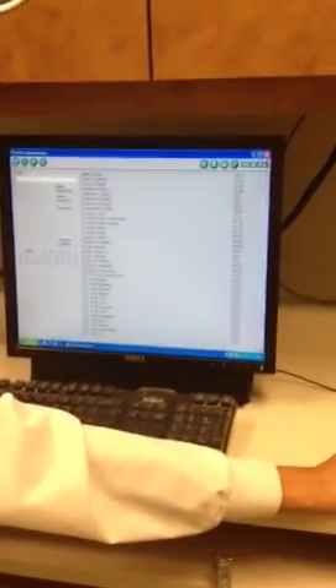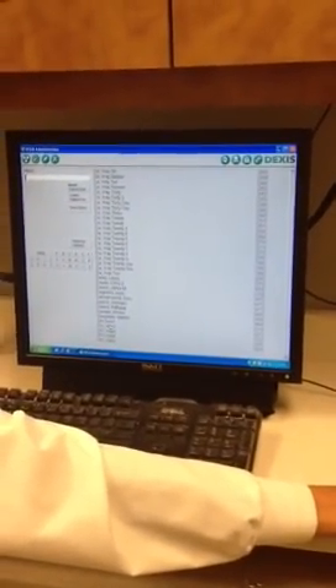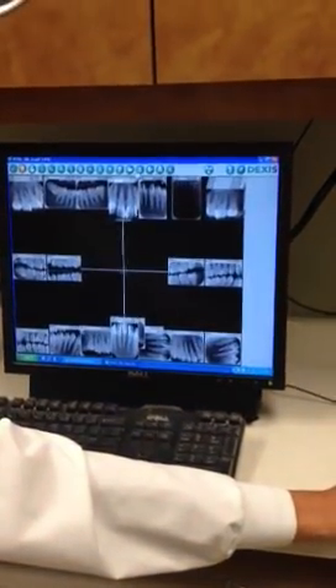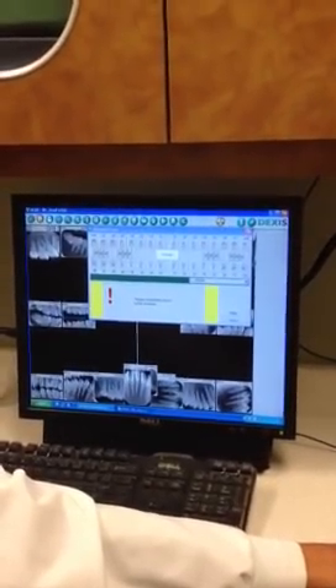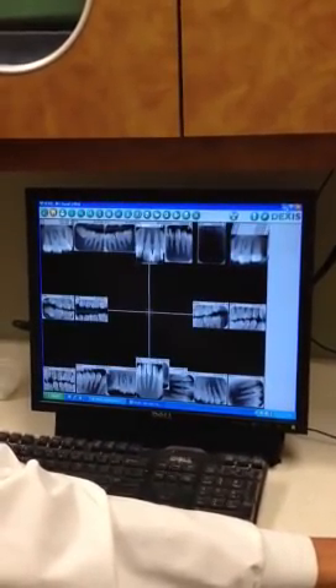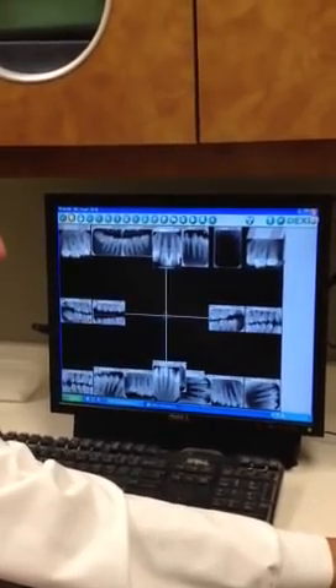Then I'll find our client and double click on the client that we want to take the radiograph on — or the image. When we're using digital, we should use the term image. Click on the radiation caution symbol, and those yellow bars show that we should not go ahead and take it.